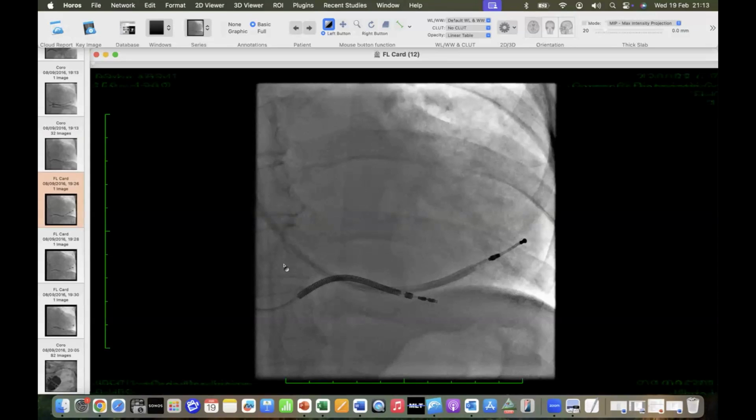Thank you. Another question, from Mohammed Jilan. From the right side implantation of defibrillator, they recommend the dual coil ICD. Do you think it makes a difference, from your practice, if you are going to implant a CRTD from the right side for any reason? Do you look for dual coil or just so for those it's not the defibrillator lead?